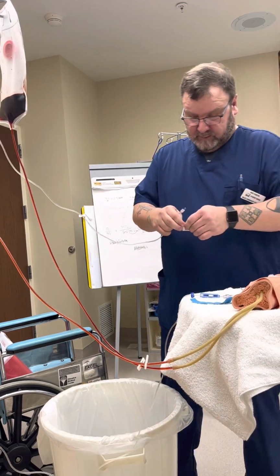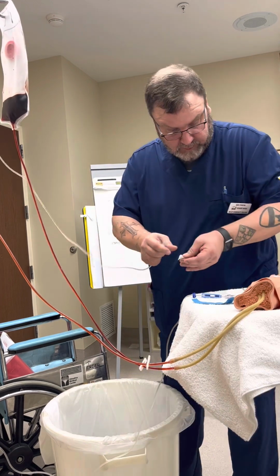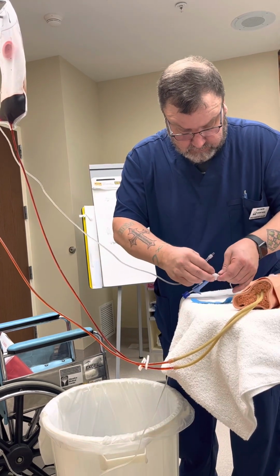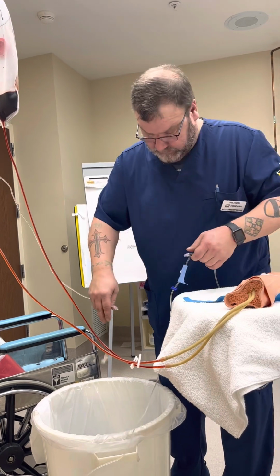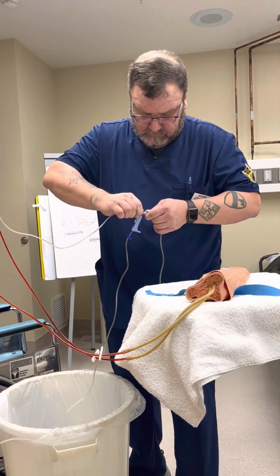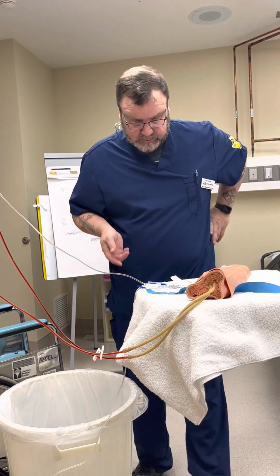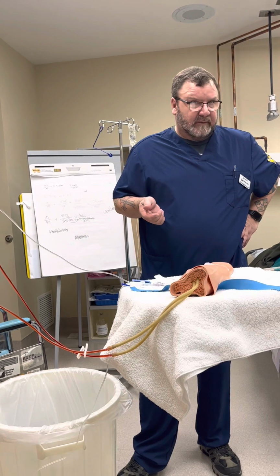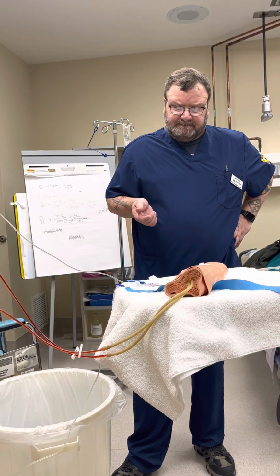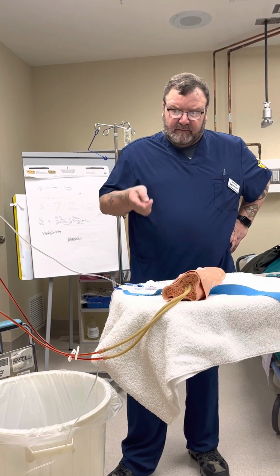And I would swab. Might as well practice like we play. Wait for that to dry. Okay, and then I need to set this up, and I didn't write it down in front of me. I believe, let me pause here.